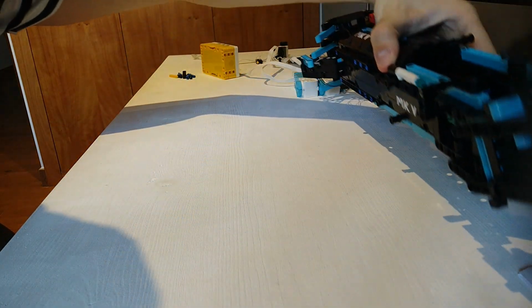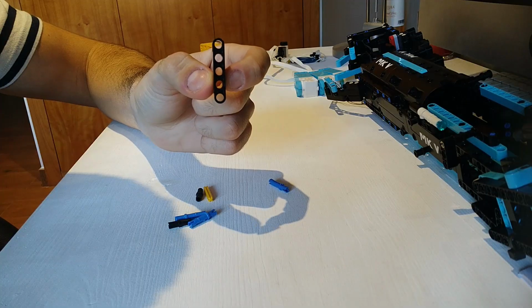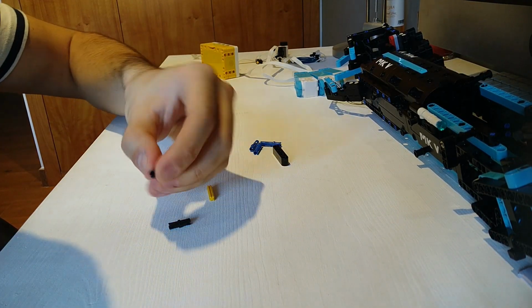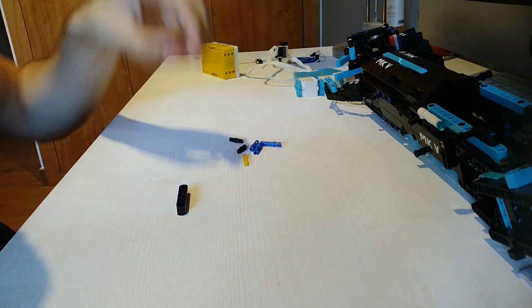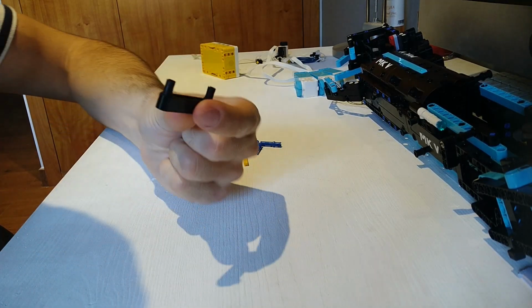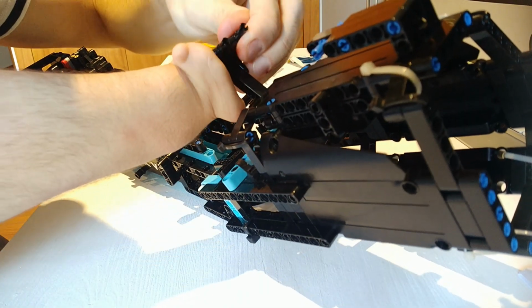Okay, once you've finished the coolest prosthetic in the world, you're going to let it rest for 5 minutes and grab these bricks. One 5 holes lift arm, 3 blue Technic pins, 2 black Technic pins, and 1 axle that's 3 bricks long. First of all, you're going to connect the black pins to the edges of the lift arm, and you should have this.